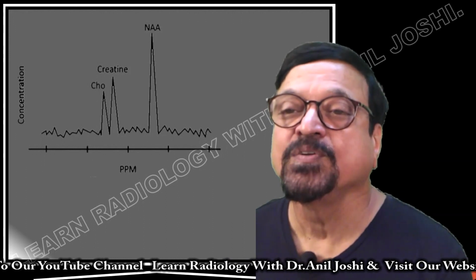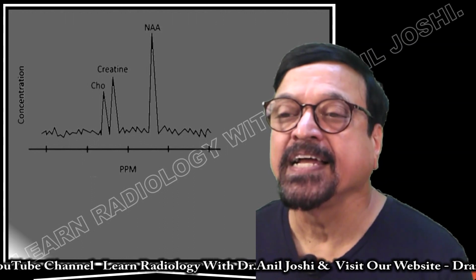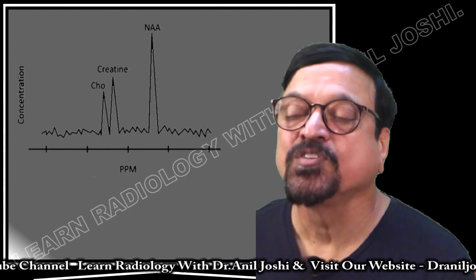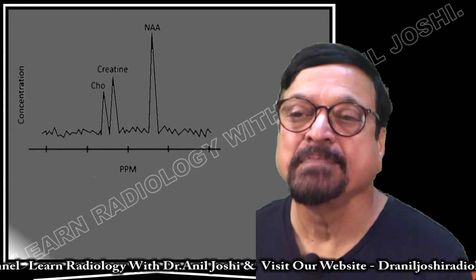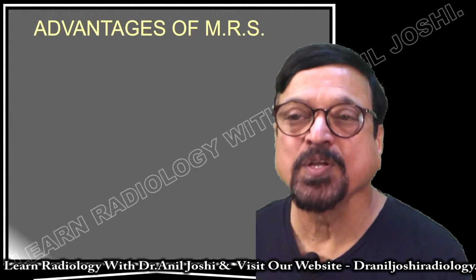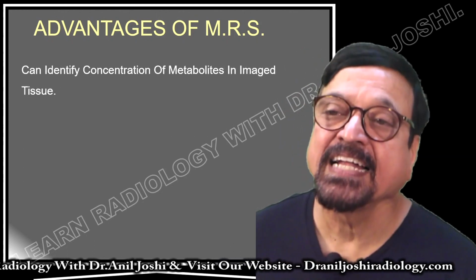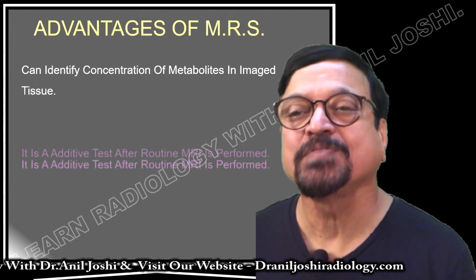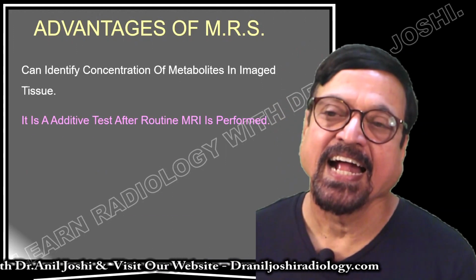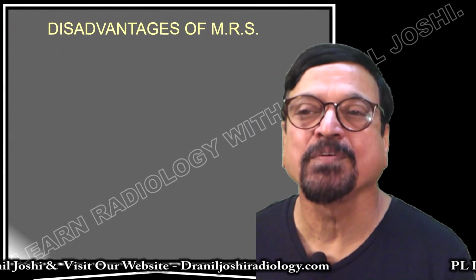Now you have got on one axis the concentration, and on another parts per million. So choline, creatine and NAA are the important metabolites, but others are also important, but these three are the most important. Now this can identify the concentration of metabolites in the tissues. So this is the advantage of MRS. It is an additive test to the routine MRI, so nothing special, just after the MRI you are performing it.